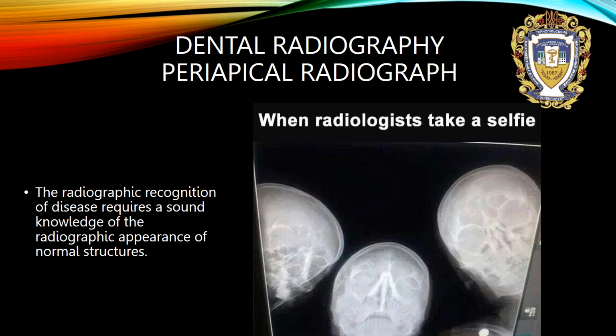The radiographic recognition of disease requires a sound knowledge of the radiographic appearance of normal structures.